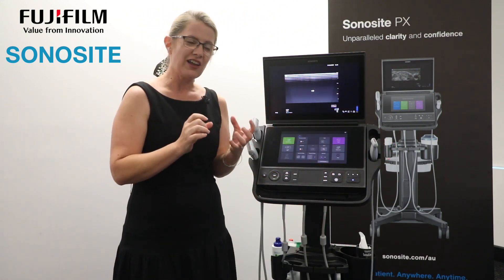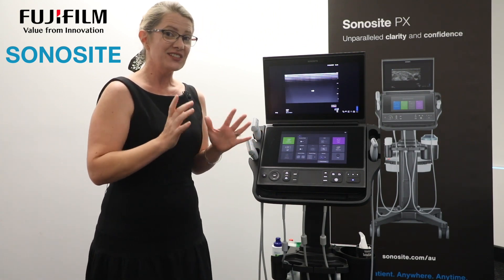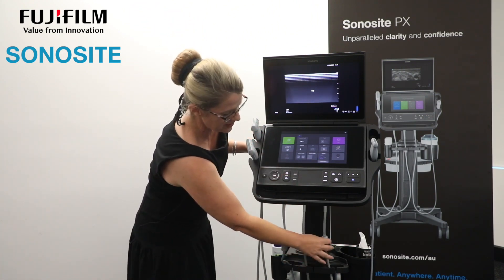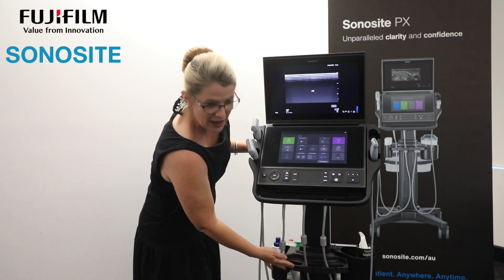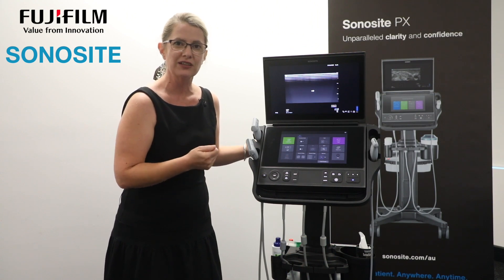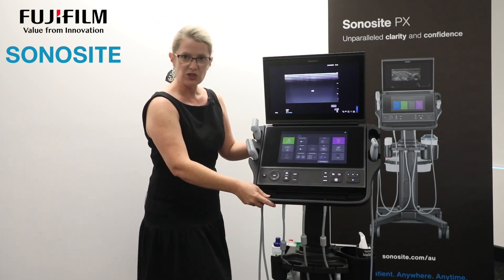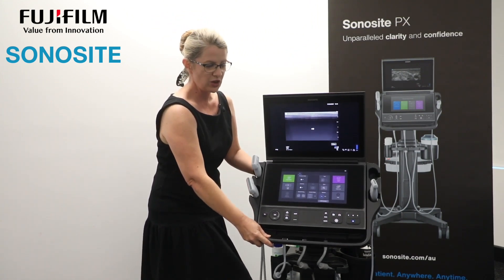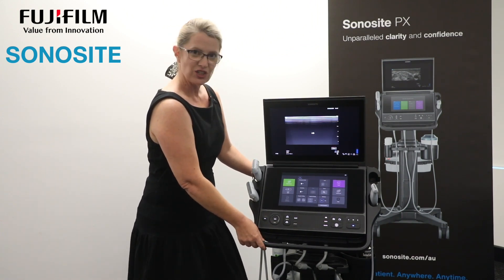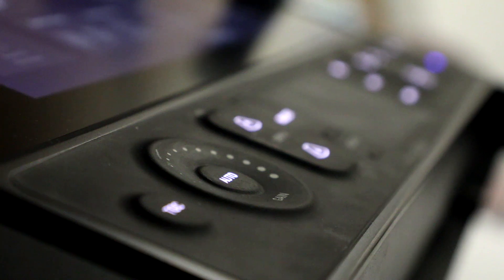The little things I like are the thoughtful inclusions that help make our clinicians' workflow so much easier. With the new cable management system — you can see down here — the cables are well above the wheels of the system. That's a real pain point for some clinicians, as wheels can run over cables. Even when the machine is at its lowest setting, the cables are still nowhere near the wheels, adding to the durable, reliable reputation Sonosight is well known for.